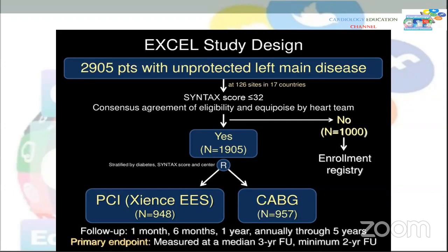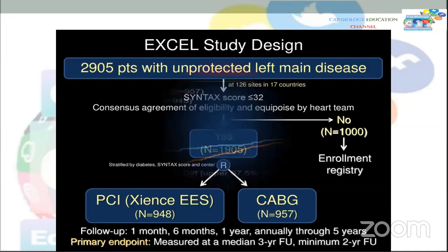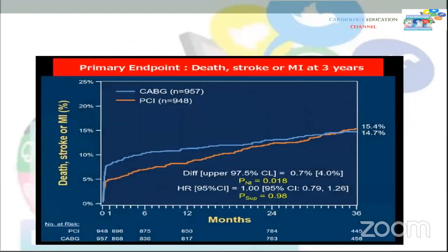The second point, now we are using drug-eluting stents of the second and the third generation. However, they are not the same. In the NOBLE, the stents used were the Biomatrix, and in the EXCEL were the Xience. And definitely we have some subtle differences that may not be similar in performance. We have some data that may point to some difference in the performance of these two platforms.